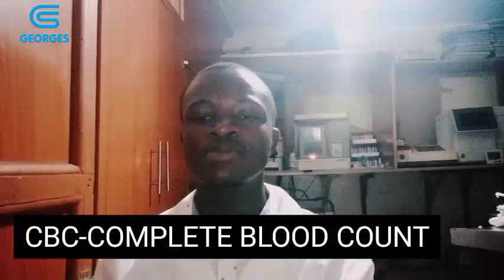So right away, let's go to the interpretation of the full hemogram report. The full hemogram report is also sometimes called a CBC or just the hemogram report. CBC stands for complete blood count, and it can also mean the full hemogram. It is one of the most commonly ordered tests in the laboratory, and definitely it is the most ordered test in the hematology laboratory. So how do we obtain the blood sample?